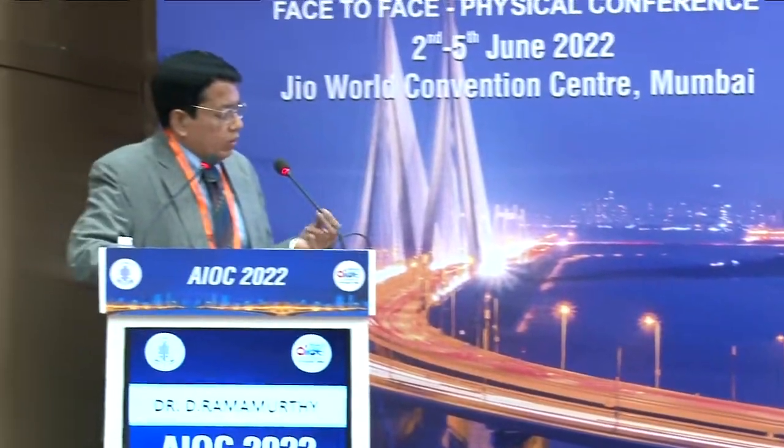See, PRK I feel is biomechanically the most friendly treatment. So whenever there is the slightest doubt about the corneal strength, biomechanics, we tend to shift towards PRK. And then SMILE is our primary modality of treatment, but all of us know that there is no cyclotorsion compensation on this. And whenever there is a significant amount of cylinder that I have to treat, beyond 1.5 diopters or 2 diopters, I go ahead and do a Contoura vision.